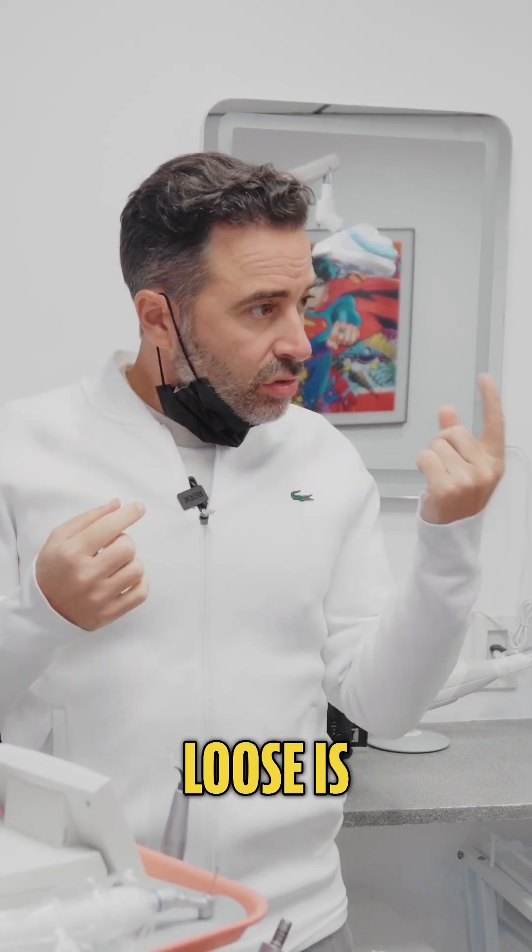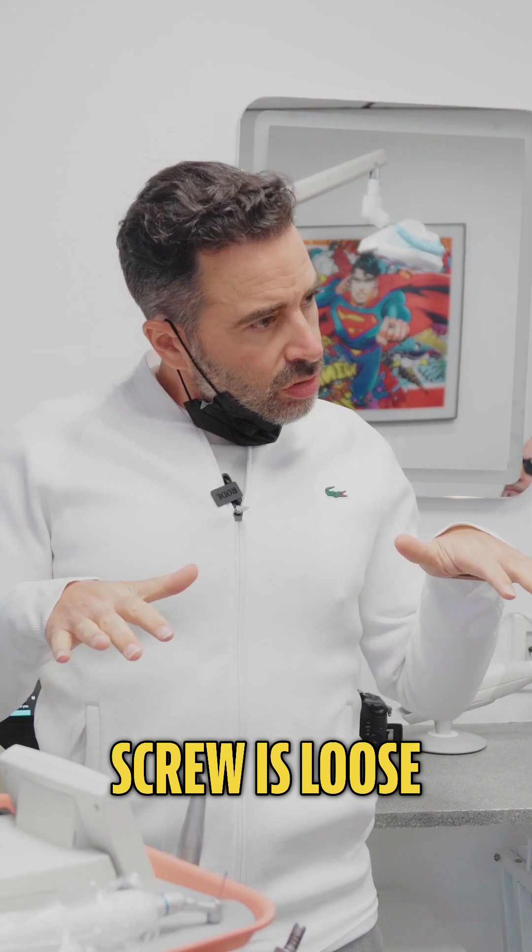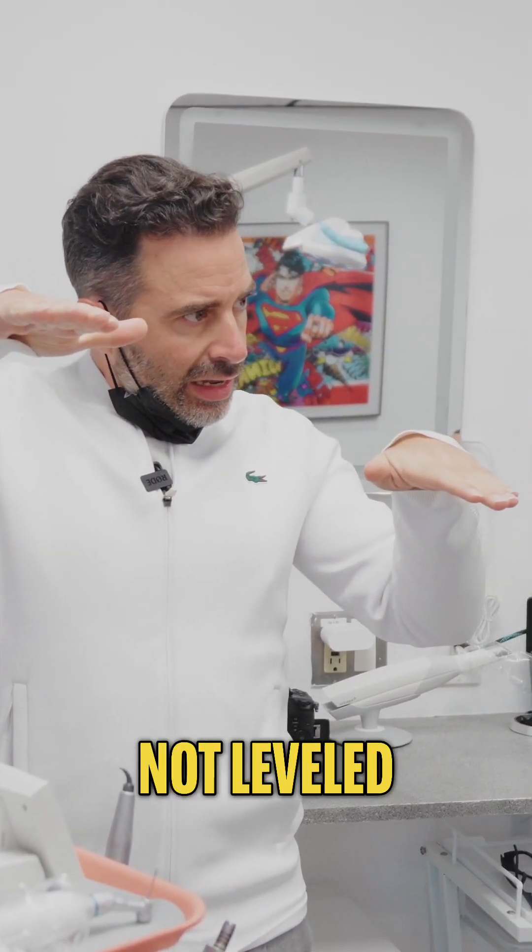What happens is the first thing that gets loose is usually the screw that's holding the restoration in. When the screw is loose it's sort of like a tile that's not leveled.